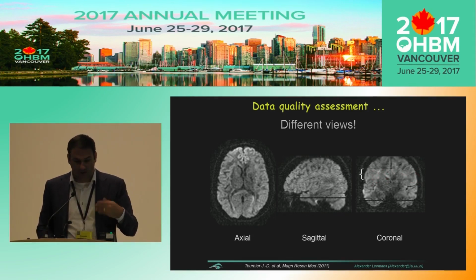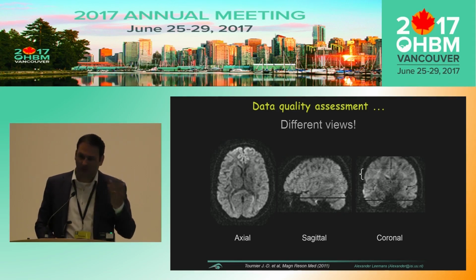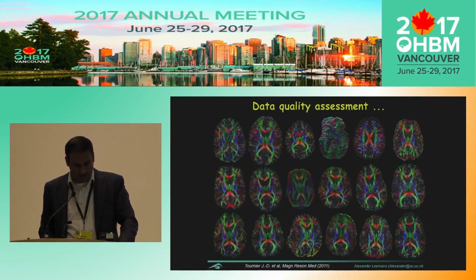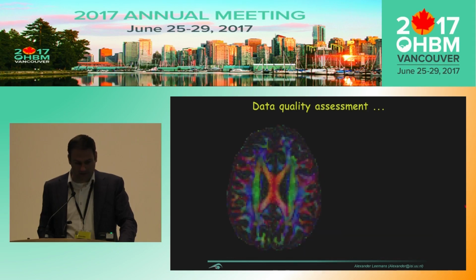Okay. So again, if this is a one-off, I wouldn't worry about it too much. But this was a systematic artifact which was present in all the data sets and at different levels across the brain for different subjects. Okay, so this is definitely going to complicate your interpretation of your outcome. Let's look at another example over here. You notice anything interesting, artifact-ish?